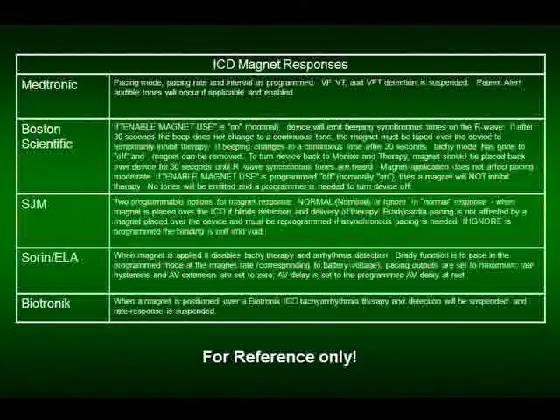I can't even understand all this stuff, and I'm not sure. I get more confused every time I read it. But in general, a magnet turns off the sensing and the tachycardia functions.